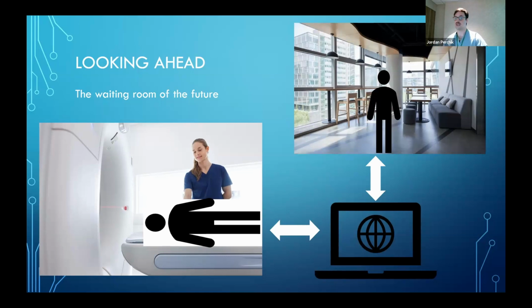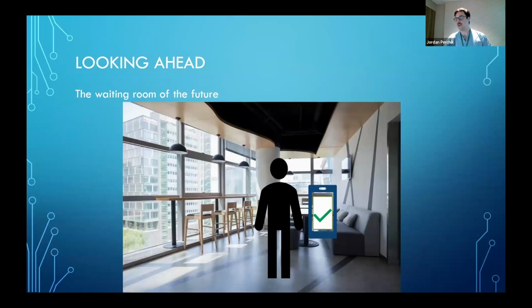This is not providing an interpretation of the entire exam, but it is looking for intracranial hemorrhage, pulmonary embolus, blood clots, free air in the abdomen, things that would really need an emergent workup, maybe an admission to the hospital. And so after the patient gets scanned, these AI applications run in the background. They get a text alert on their phone saying that they've been cleared for discharge. And this is before the human radiologist would even be able to look at the exam, because it's happening just so quickly in the background.